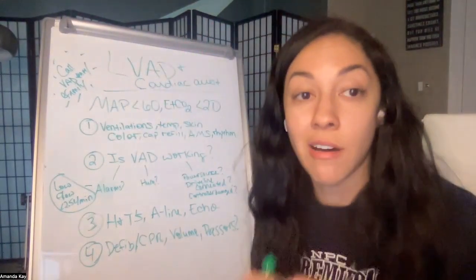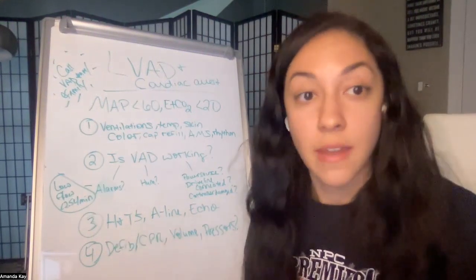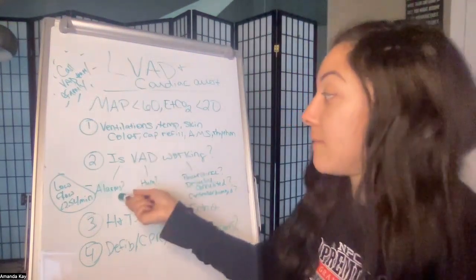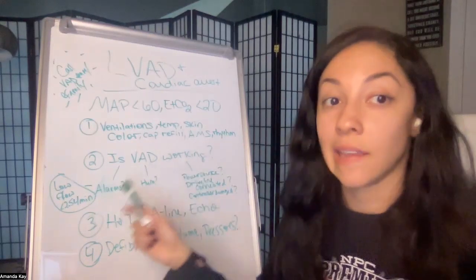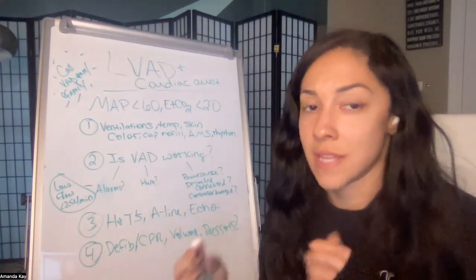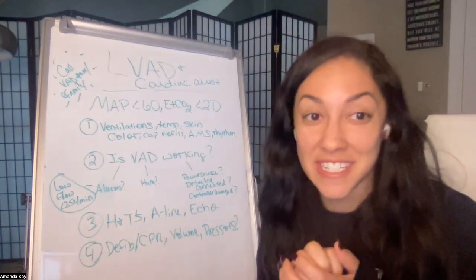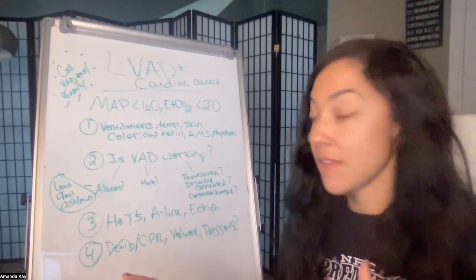Then you should have somebody on that VAD. Is that VAD working? This is why you're going to get on the phone with that clinical coordinator, the VAD coordinator, ASAP. Is the VAD working? First of all, are there any alarms going off? We'll talk about a low flow alarm in a second. Second thing, auscultate. You can hear the hum. Do you hear that LVAD hum, or does it sound kind of funny? Get online, see what that hum sounds like, so you know if it sounds different, right? But are you hearing that hum, or is there literally like nothing?